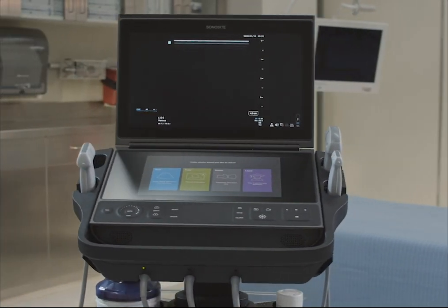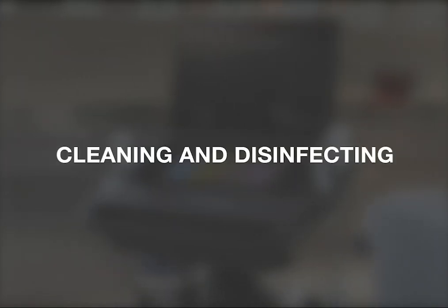Welcome to the help video: Cleaning and Disinfecting Your Ultrasound System. In this video, we will walk you through cleaning and disinfecting both the system and the transducer. For the purposes of this video, we are using a Sonocyte PX system.